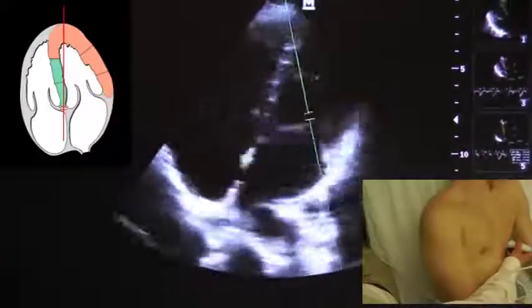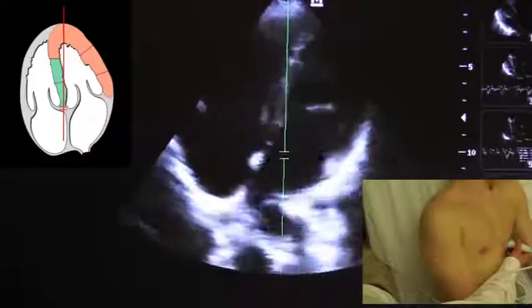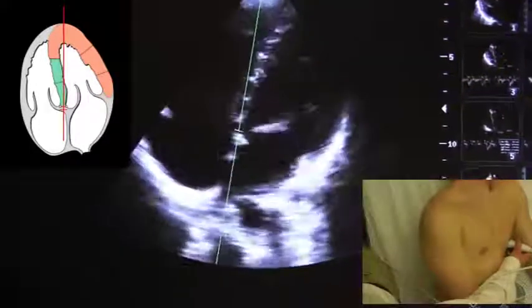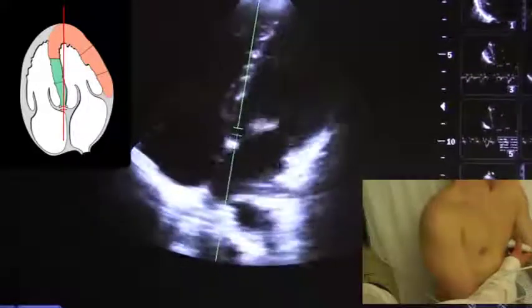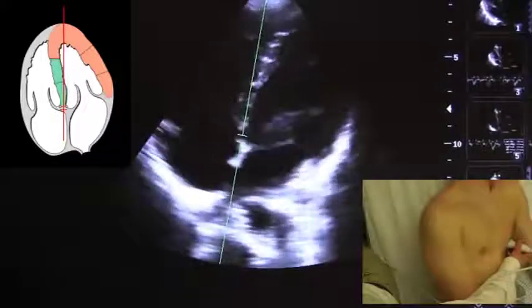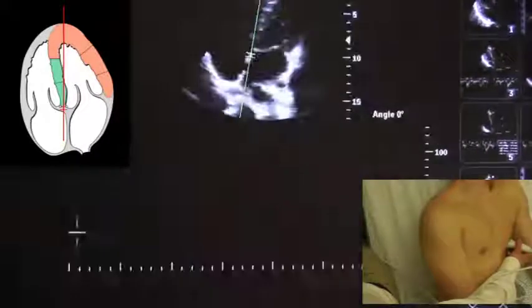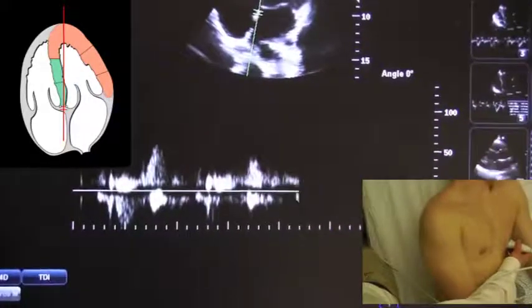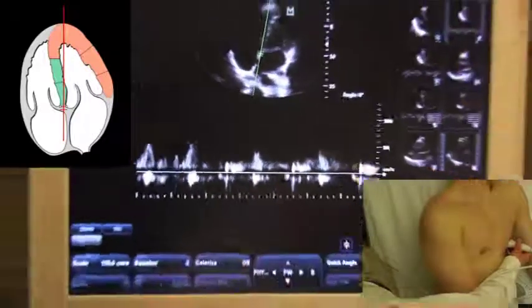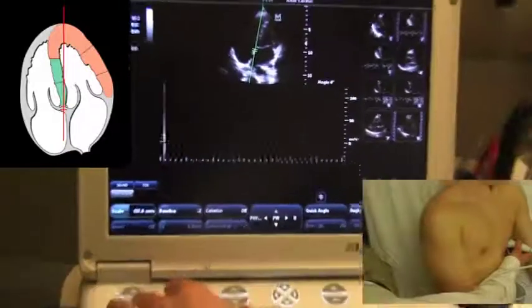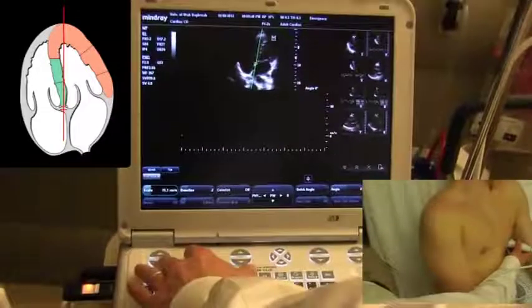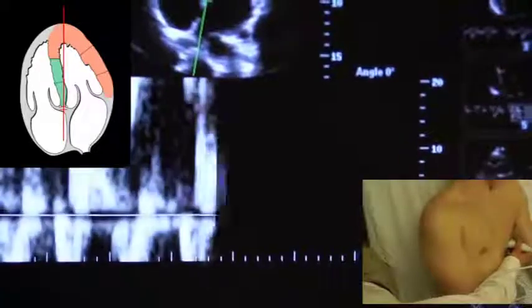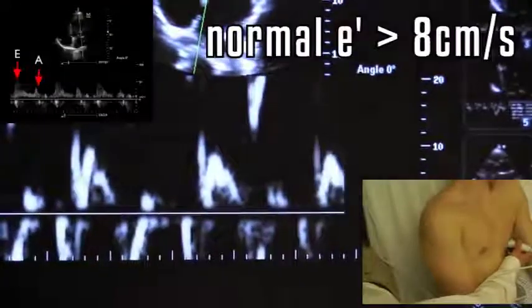Next, I'll want to get the TDI of the mitral valve, so I'll move the pulse wave gate over to the mitral annulus and hit PW again. I'll need to adjust the scale to about 20 cm per second. I'll also need to adjust the baseline up, so that I'm looking at the negative portion of the scale. Finally, I'll want to reduce the gain.